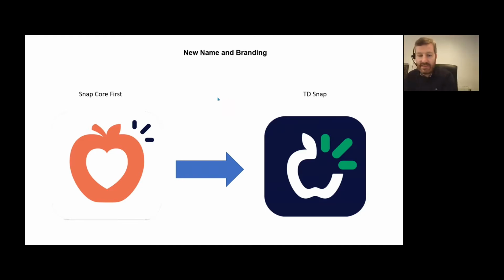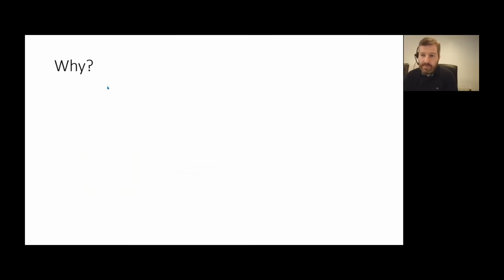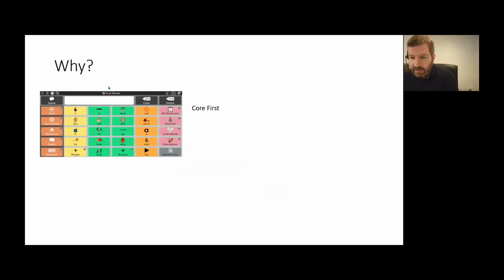So again, these things can cause confusion. We were getting a lot of questions and emails saying, what's this new software, TD Snap? So we just wanted to do some webinars and put some information out there that it's mainly a rebranding of what you may know as SnapCore First. The reason why they've rebranded and renamed it is, as we've talked about previously, that many of you may know it as SnapCore First.